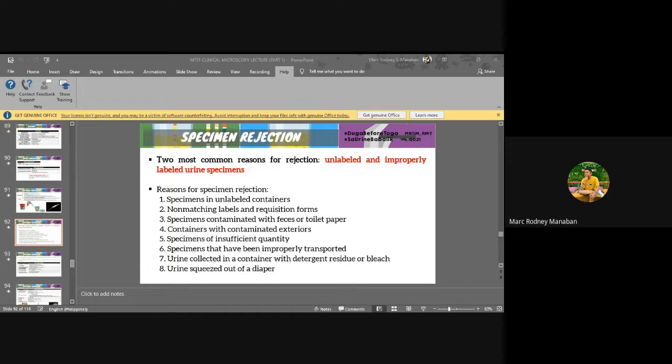Again, ayun, depende siya sa medtech because yung ba medtechs na mo agree ra. So again, if gamay na kayo ang volume, dears, expected na hindi mo siya ma-process sa machine because the machine would require you to process it in a higher volume. Okay? So, ang imong buhaton na lang is manual. If makaya na siyang manual, i-tilt ang imong test tube for chemical. So, depende sa medtech ang mo process. Pero if ang medtech okay ra, kaya ra na siya, then you accept it. Pero theoretically, dapat i-reject siya.